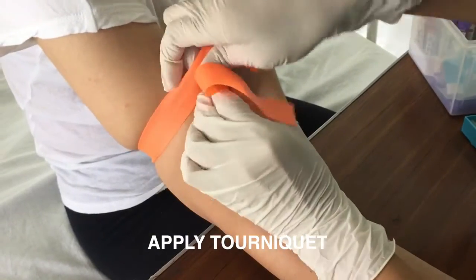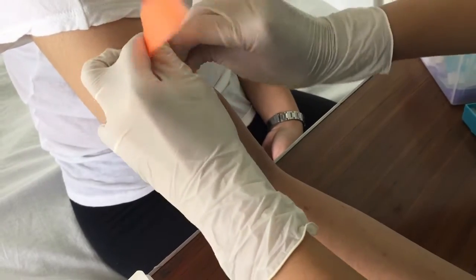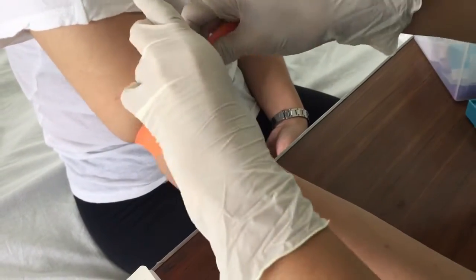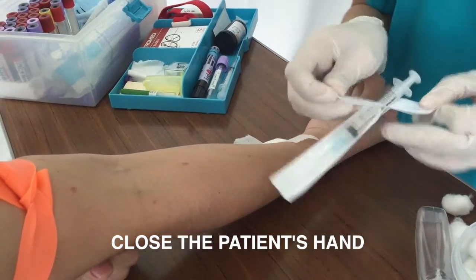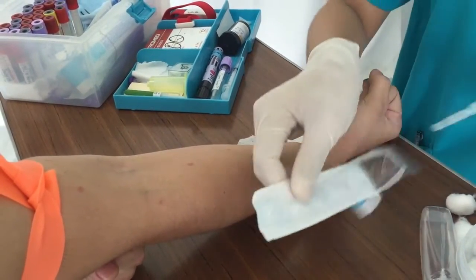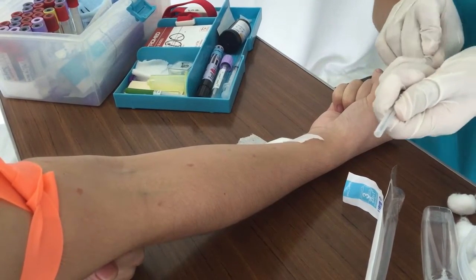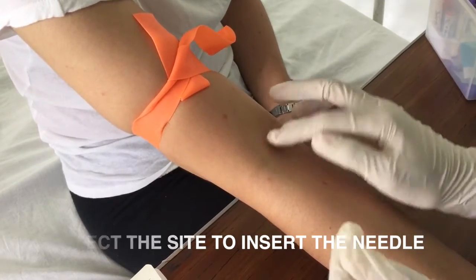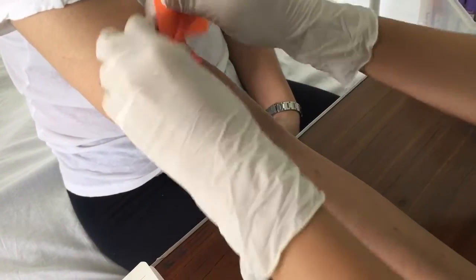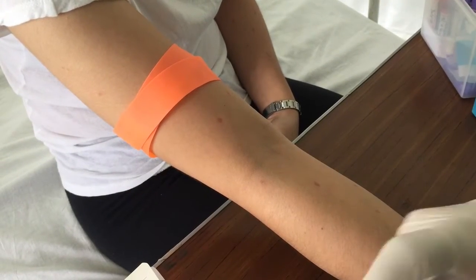Apply the tourniquet on the arm of the patient 2 to 4 inches above the site. Have the patient close their hands and ask the patient to make a fist — never have the patient pump their fist for more than 1 or 2 times. Select the site to insert the needle by finding the most prominent veins such as the median antecubital, basilic, and cephalic veins.